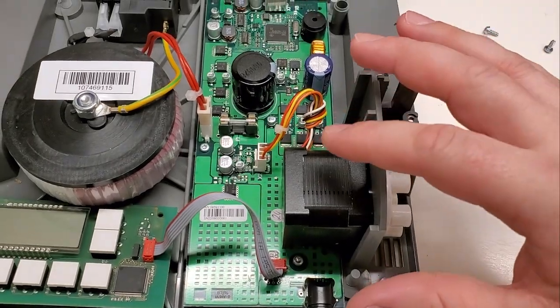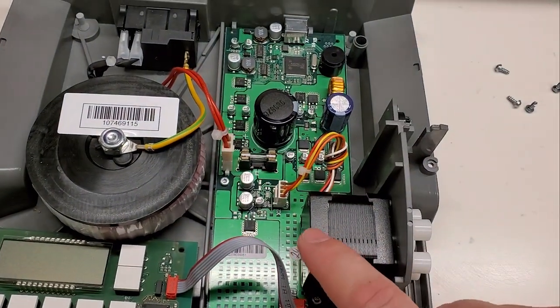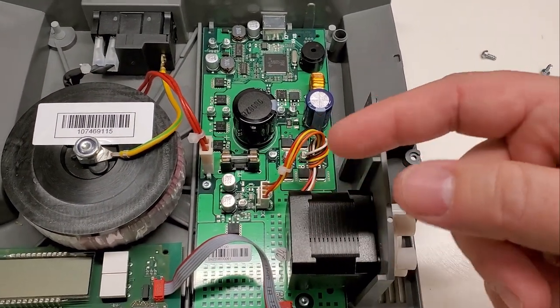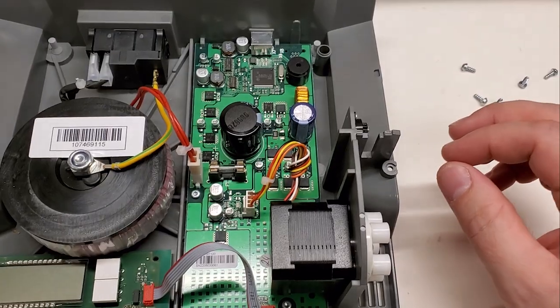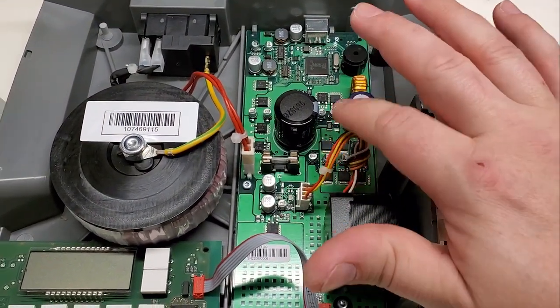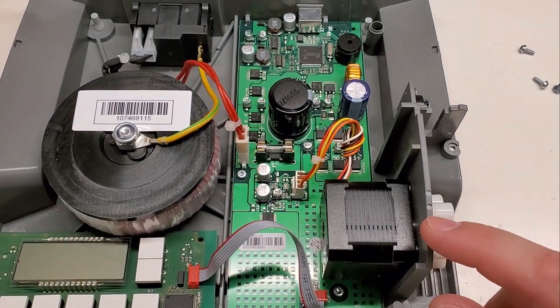But without current sensing, which I don't see any shunt resistors in here, you would know. A big shunt resistor would be a large piece of metal that's in here. Without a shunt resistor or current sensing coils, this is really just a stupid circuit. It doesn't really care, and you have your stepper motor.